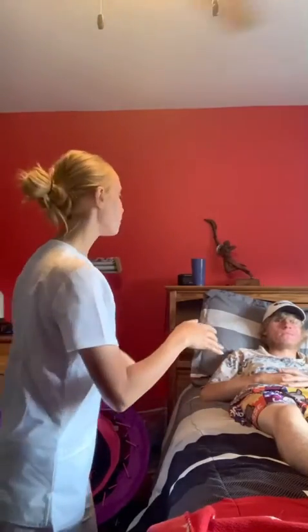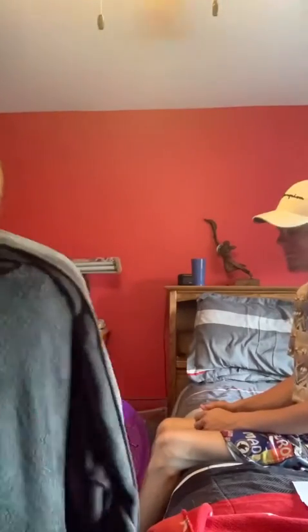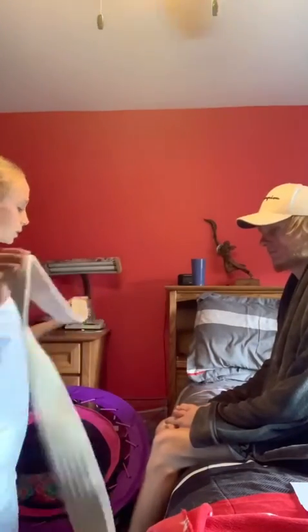And now after this, I am going to help shift my patient to the side of the bed. And then, okay. So now his feet are flat on the floor. And now I'm going to apply his robe on him.